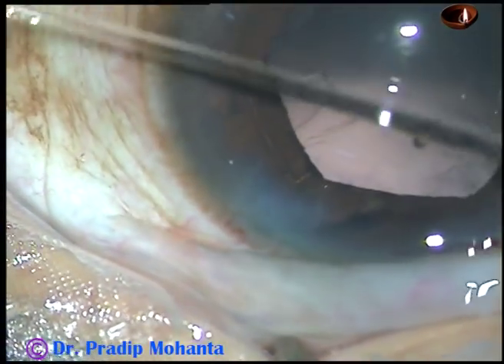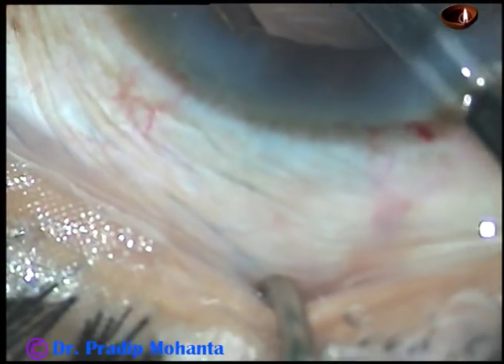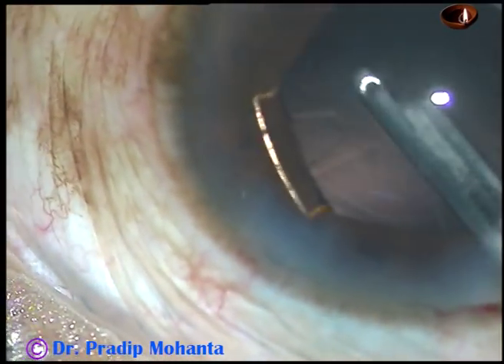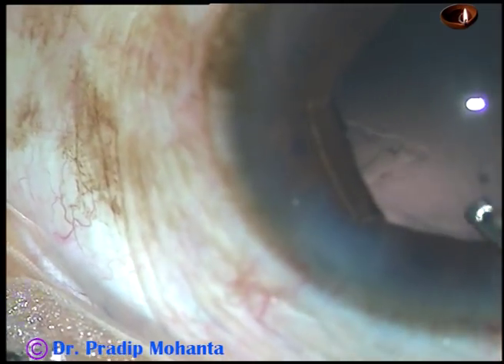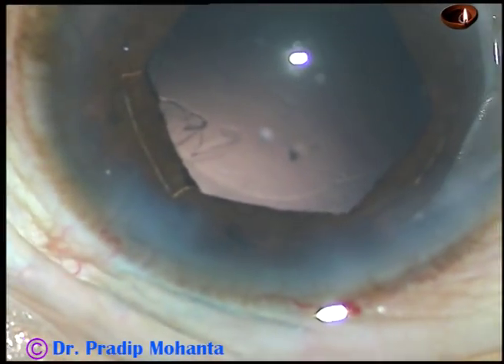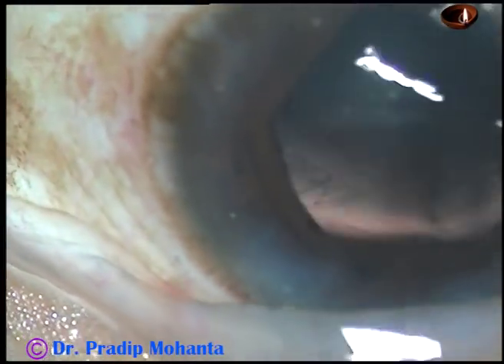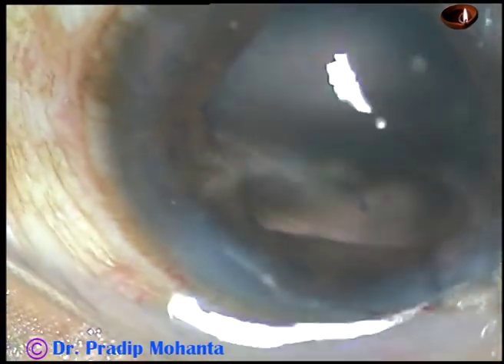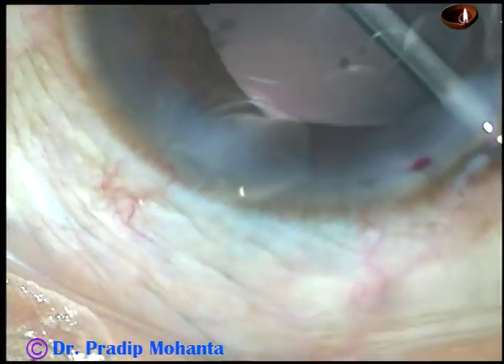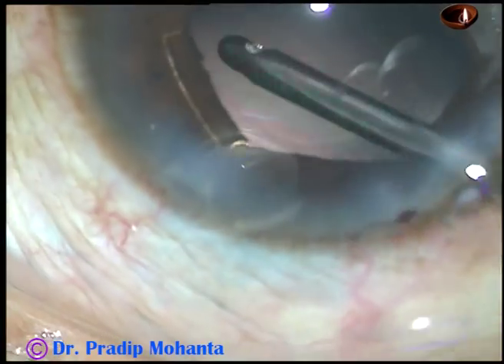Dear colleagues, we must remember that in small pupil cases, we must try to do good hydrodissection and rotate the nucleus as well as epinucleus nicely before introducing the phaco handpiece — which I did not do in this case. I am a very confident surgeon and I thought I would be able to do it even though the hydro was not good, because I have done phaco even without hydrodissection. But it did not work in this case because there is a B-hex, the pupil is not dilated, I cannot see well, and my field of vision is small.